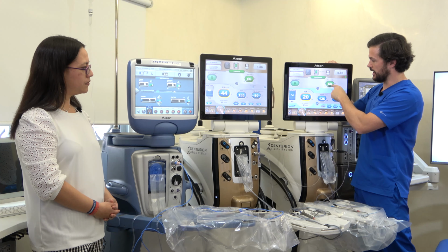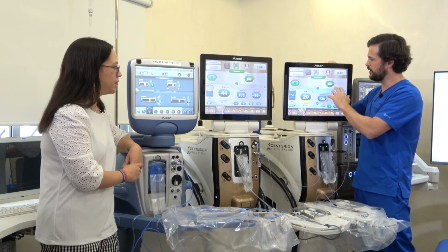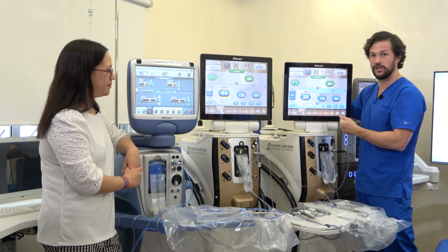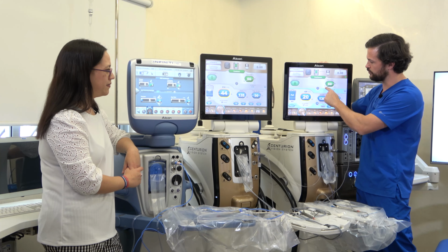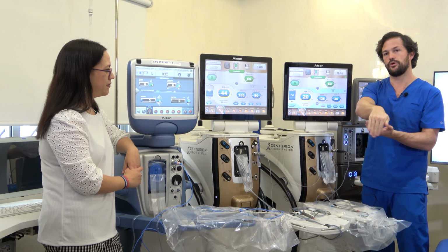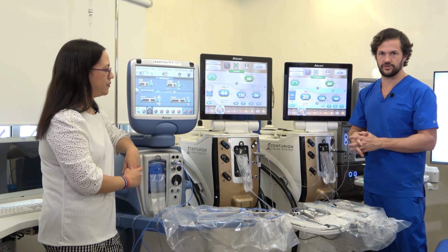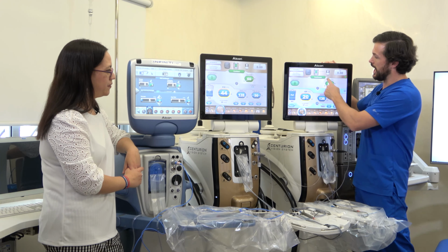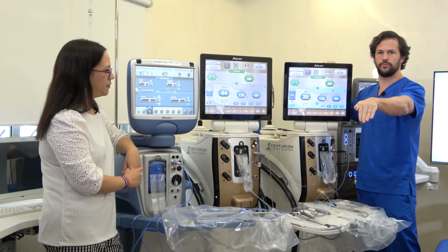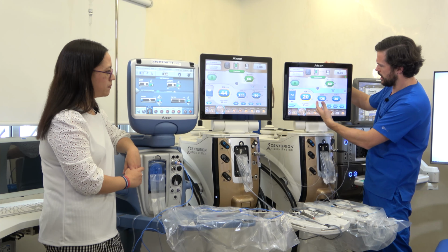You want, remember, 60 of ultrasound in this machine. It's very powerful. Maybe you can raise it in a very hard cataract, but this is going to be your starting point. Another important thing is you start with 10, not 0, and that's because the ultrasound is more efficient if you approach the lens already with ultrasound on. Very important. And continuous. Okay, in this case what you want is ultrasound to be delivered. You don't want to save ultrasound.